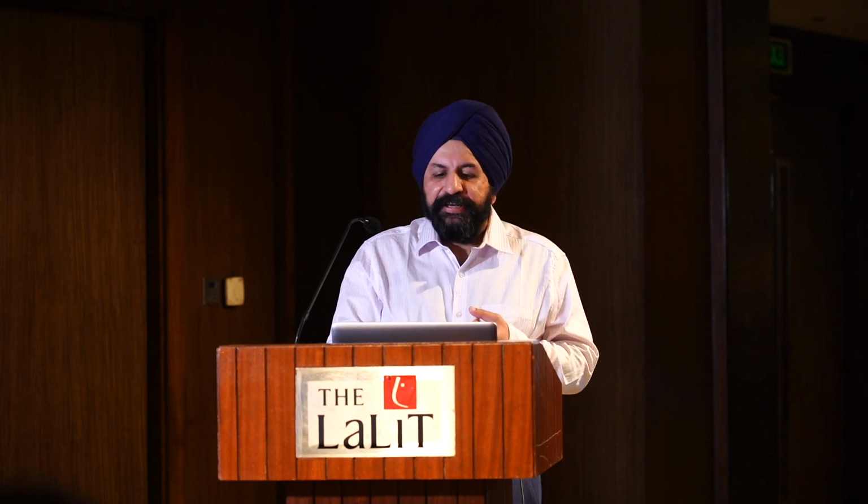So just similar to immature platelet fraction, HFC on its own is an important prognostic marker for the platelet recovery in dengue patients. Also, I have got now my own algorithm where if the HFC is more than 5%, platelet count is less than 50,000 and IPF is more than 20%, it is dengue even when you are serologically showing negative, because there is a lacuna in the serological test also.